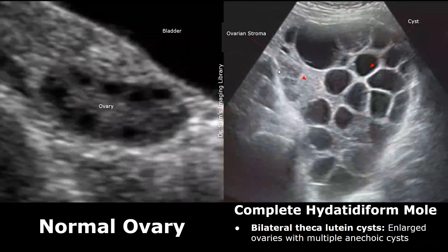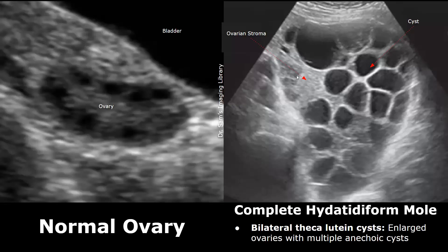The ovaries can also be affected in a molar pregnancy. Theca lutein cysts are seen, and it usually presents with bilateral theca lutein cysts. The image on the left shows a normal ovary in a transabdominal image. In the image on the right, you see an enlarged ovary filled with multiple anechoic cysts. The echogenic area is the ovarian stroma. Both the right and left ovaries will be enlarged and will have this type of appearance.